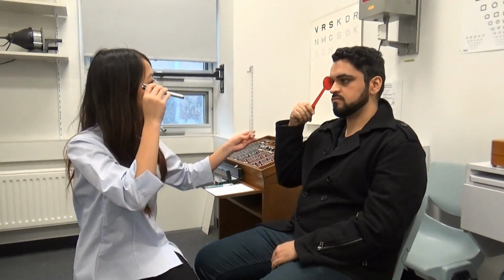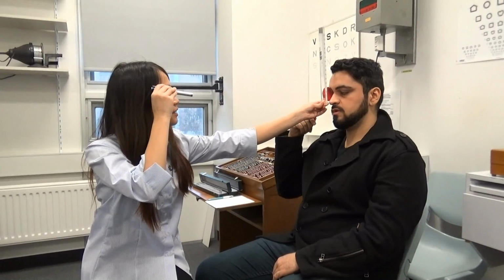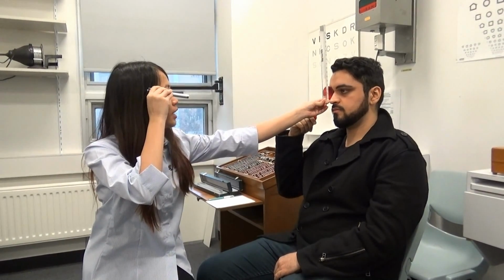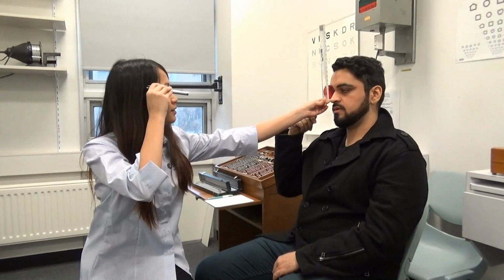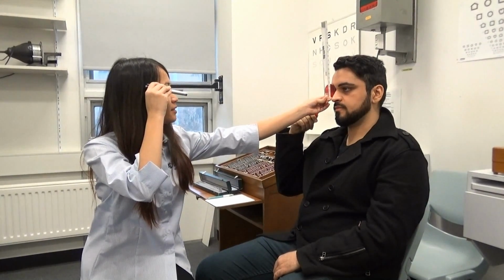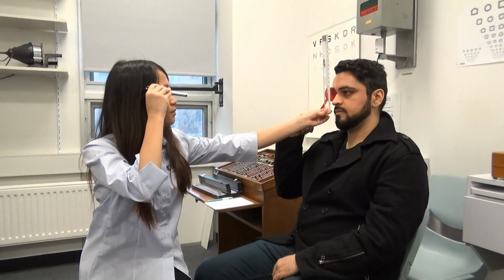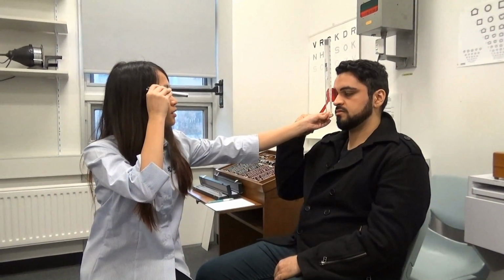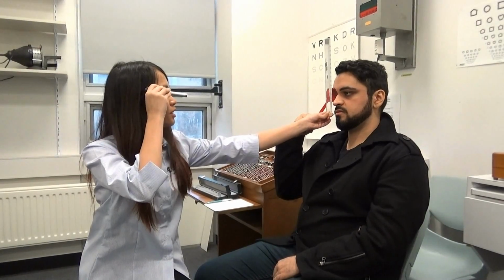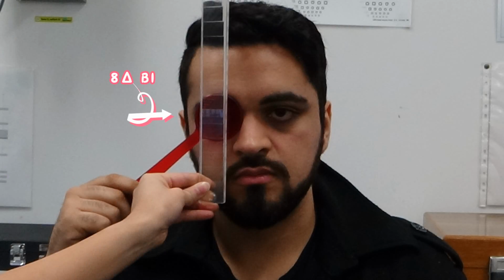So now I'll be introducing you to this prism. I'm just going to put it against your right eye. So tell me when the light goes over the vertical line. I'll just be starting right now. Is it getting closer? Yeah, it's on the line. So the light is on top of the vertical line? Vertical red line, yeah? Okay. 8 diopter base-in prisms was used to correct this deviation.